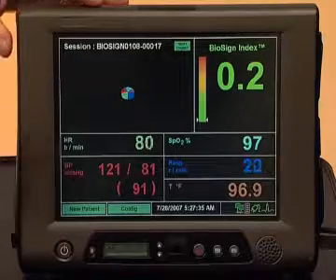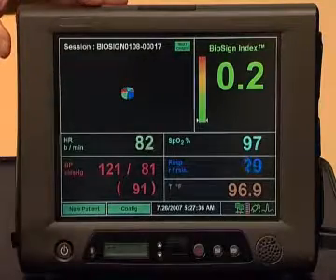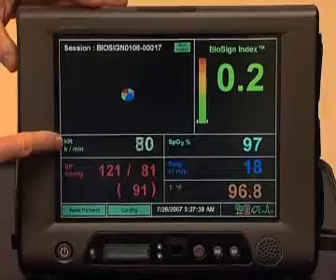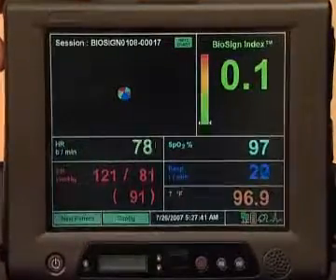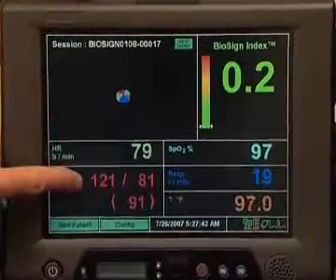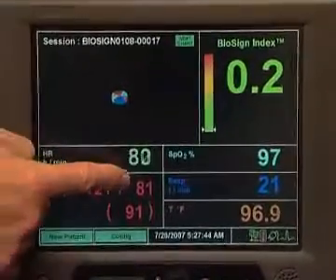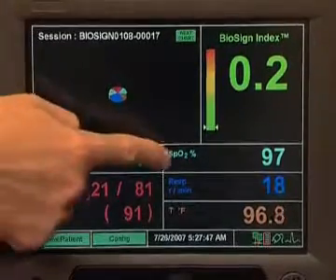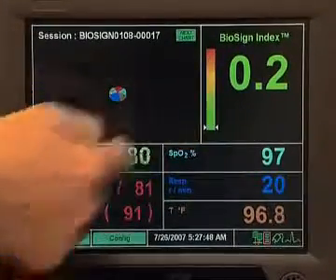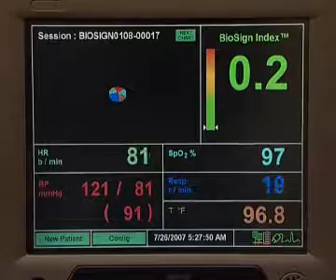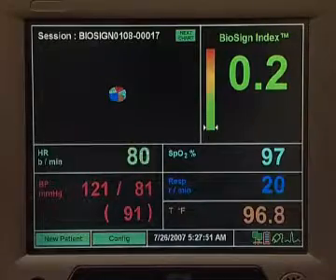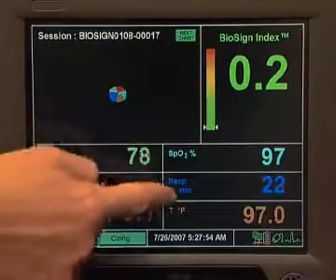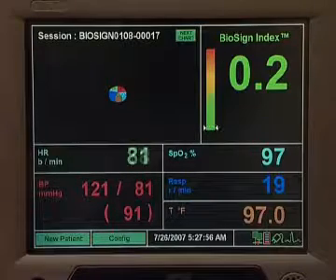What you have are the parameters coming in from the patient monitors. So you have the patient's heart rate, 80 beats per minute here. Their last blood pressure, 121 over 81. Their oxygen levels, 97% saturation, which is fine. Their breathing rate, 20 breaths per minute. And their temperature in Fahrenheit here.